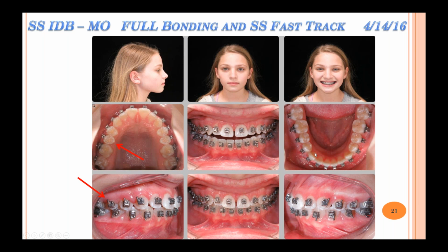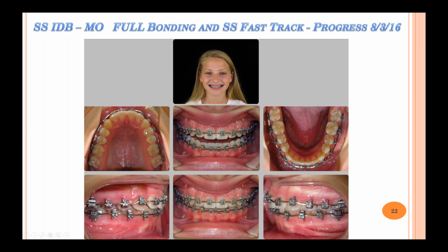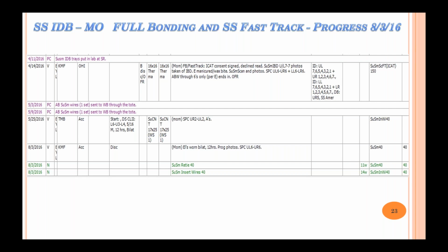Okay, and you can see here what's changed with the brackets on, and I direct bonded the bracket here. And then this is a progress photo, August, so less than 4, let's say 3.5 months later. I mean, just look at this. The case is actually almost completed. I got a little space close up here, but the wire is still expressing itself. I usually let my SureSmile wires work for a minimum of 4 months, usually 5 months, somewhere in that ballpark.